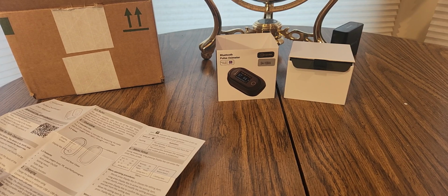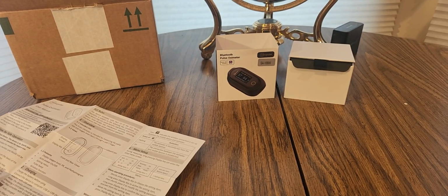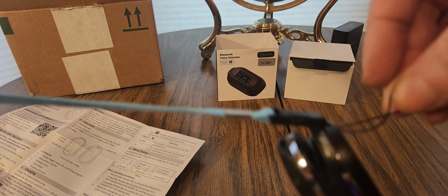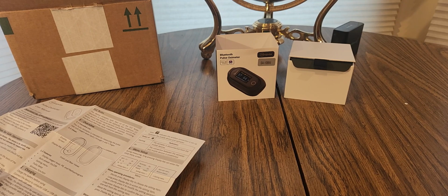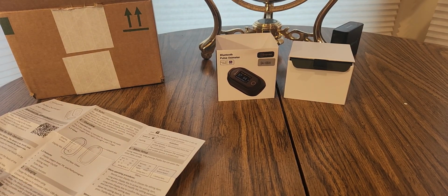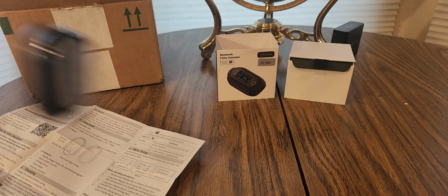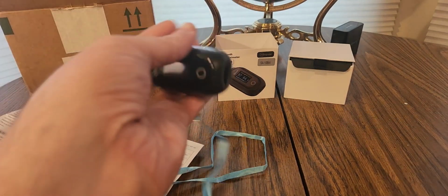Got to pinch and loop it through. It's always a fun part. There we go. It's kind of hard to see, loop it through. There we go. Perfecto. You know the drill. Make sure it's nice and tight. And you'll be good to go. Make sure you get that out. There we go. See? You can have it around your neck. And then you're good to go.